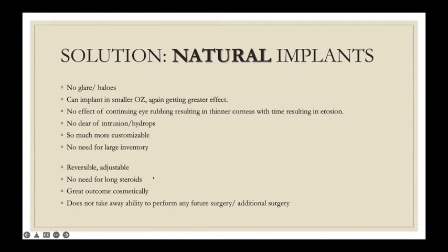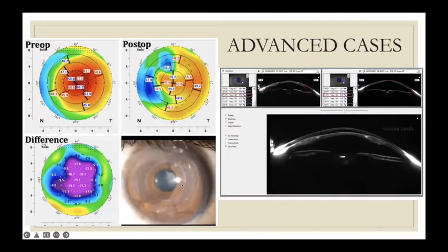It's also reversible and adjustable, and there's no need for long steroid usage. You have good outcomes cosmetically, and again, it does not take away the ability to perform any kind of future surgery, including DALK or anything else, or even topo-guided PRKs or phakic IOLs, ICLs, or any of those surgeries. They're all compatible with CAIRS.